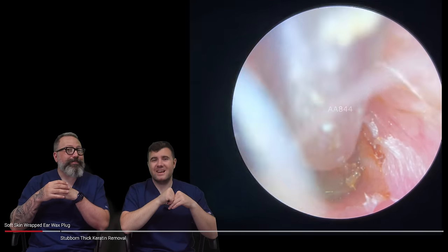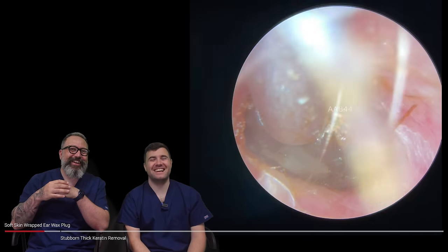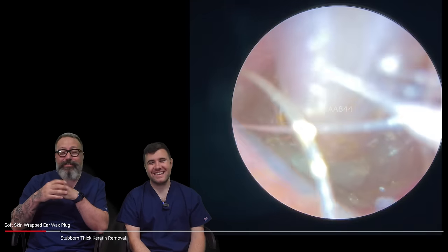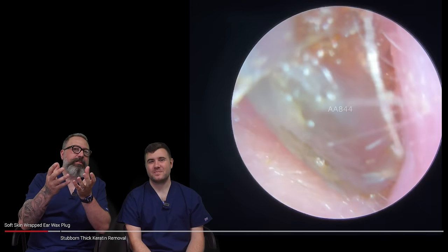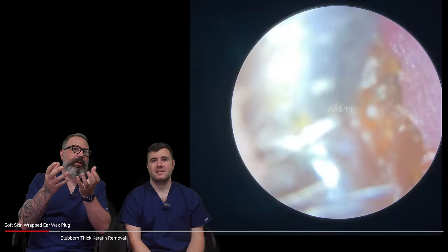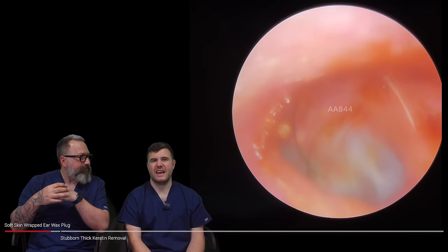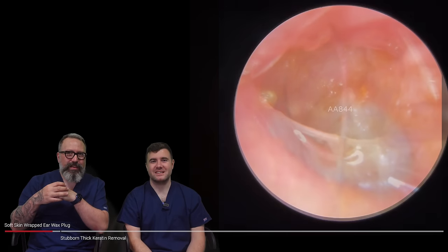We call it clarinetting. I think it's wrapped in this sort of skin parcel, like a dim sum wax skin bundle. Yeah, you could see that gray sort of material on there, really deep in the canal. But that's coming out really well.